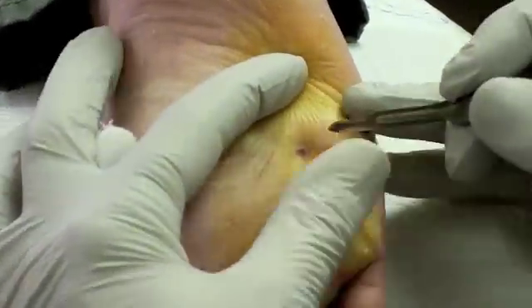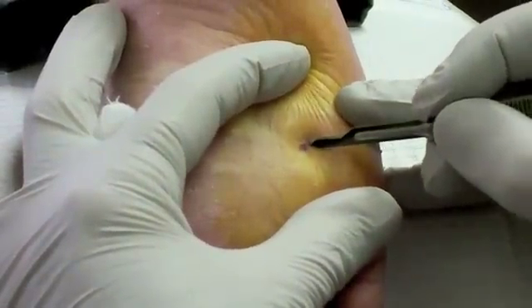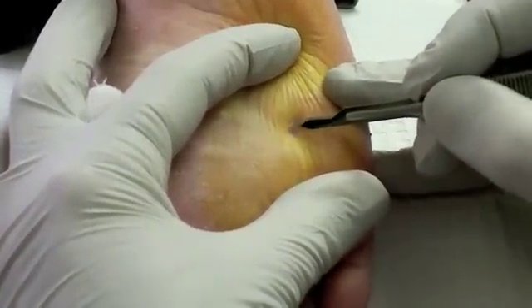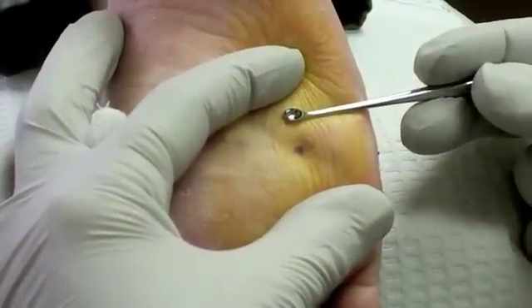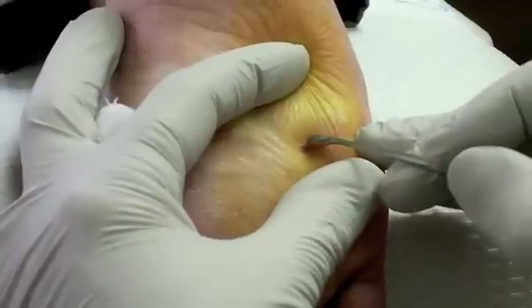So we're going to make a little nick in the end over to the outside, just off to one side. And with our curette, we're going to go ahead and scoop.